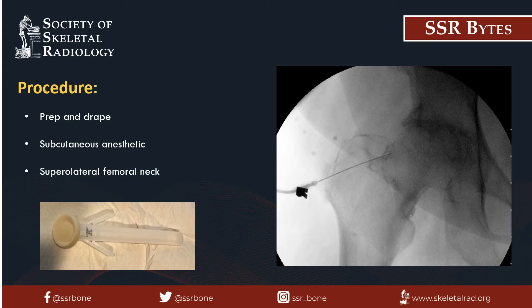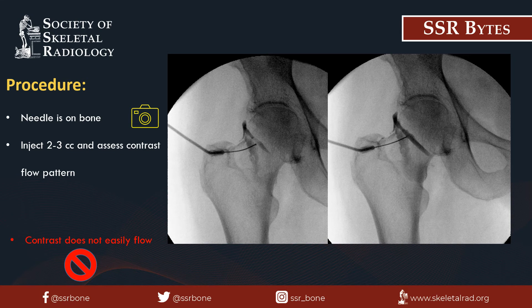Once the area is anesthetized, the spinal needle can be inserted at the same site. It is important to make sure that the area you're inserting the spinal needle is the same area that you numbed with the anesthetic. The spinal needle is then guided to the bony landmark of the superlateral femoral neck. Use fluoroscopic guidance intermittently to check the position of the needle as you advance it. Adjustments may have to be made if the needle is not along the expected trajectory. Here's an example of an injection with an oblique approach — notice the severe osteoarthritis on this fluoroscopic image.